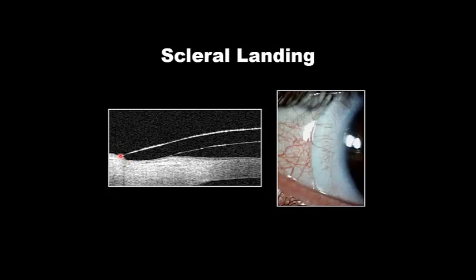This is probably due to the fact that the degrees of scleral angles are quite broad across most eyes. So some patients will get by with standard angle, some may need a much flatter angle because their underlying surface is much flatter. And when they do have that flat scleral angle surface, we're more likely to have a lens that slightly impinges, where we'd want to call up the Cardinal consultant and ask for a scleral landing zone -1.